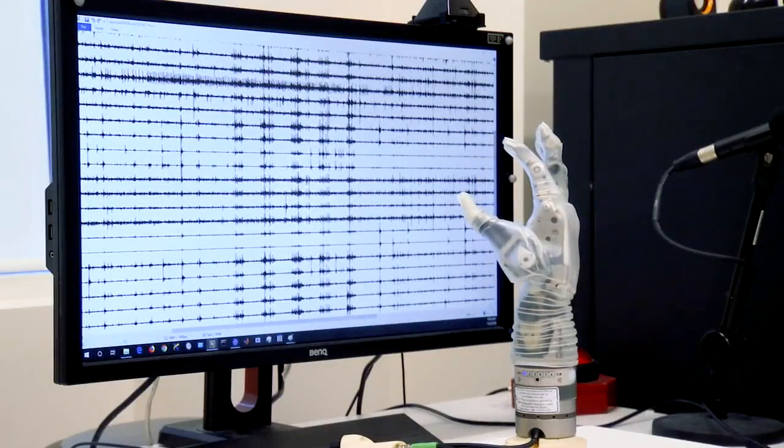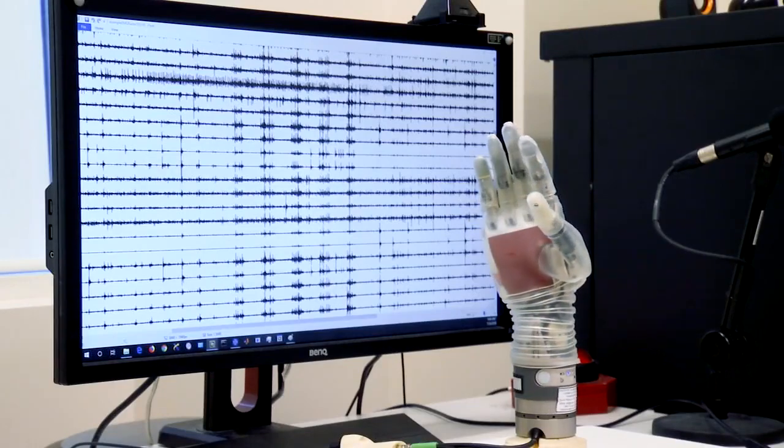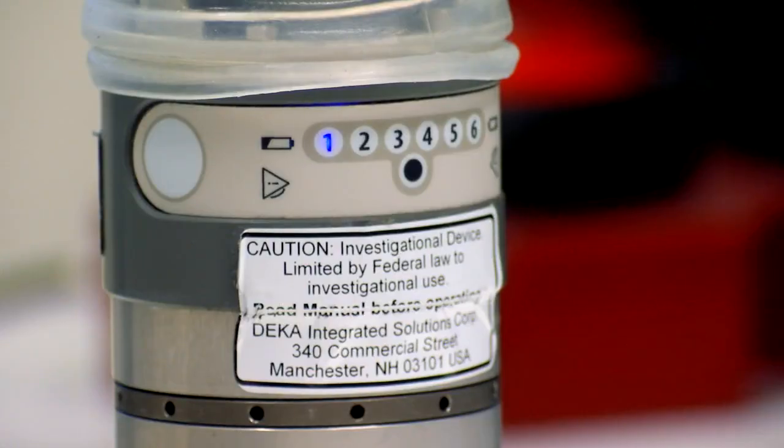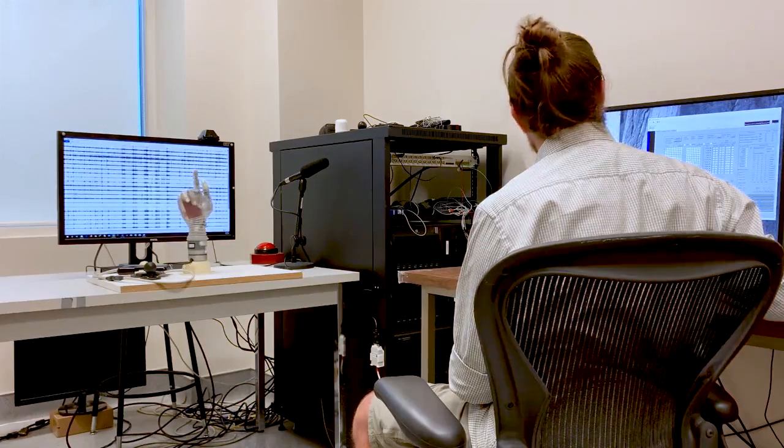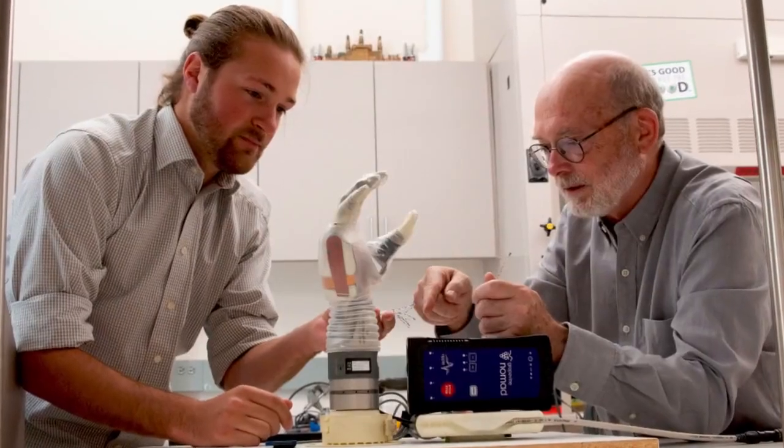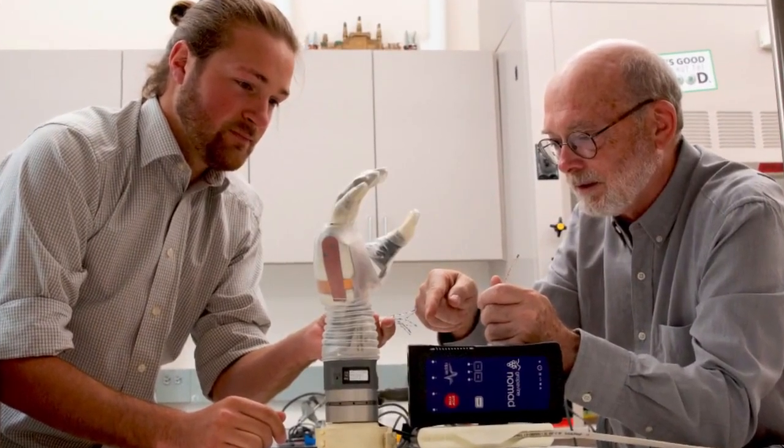And so as a person or an amputee thinks about moving their hand, we would be recording those signals and intuitively providing them with control. The team is waiting for FDA approval on another round of clinical trials, this time where the amputee can wear their Luke arm home.